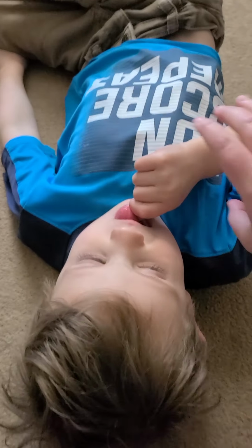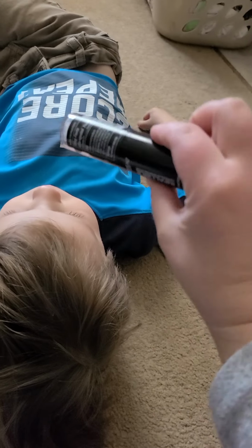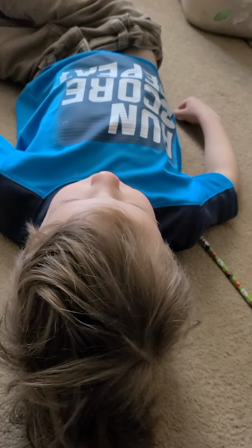First we're going to flip this around, and your patient needs to be laying supine. You're going to be behind the patient's head for this exam. I have my little pretend transducer here, just my makeup stick. I couldn't really find anything else.